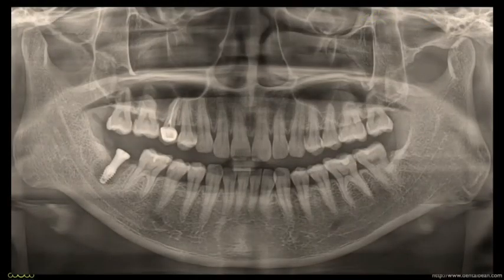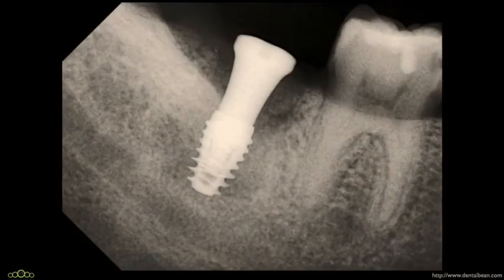Post-operative panoramic radiography image. I tried normal drilling, but the middle to coronal bone density was not so dense. As a result, insertion torque was relatively low. But I connected the healing abutment for convenience of the apically positioned flap.